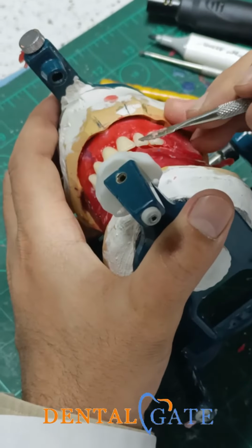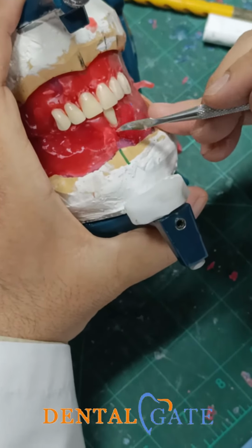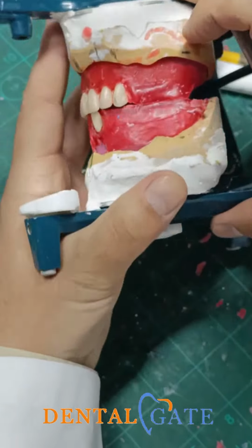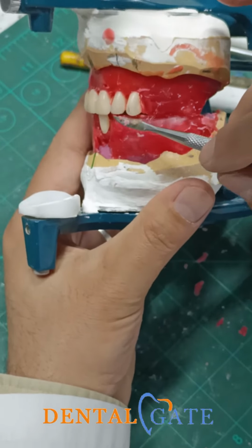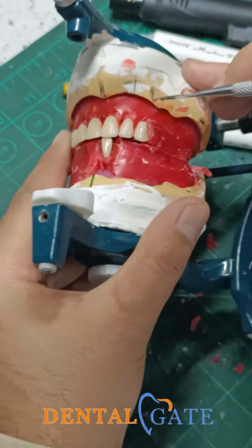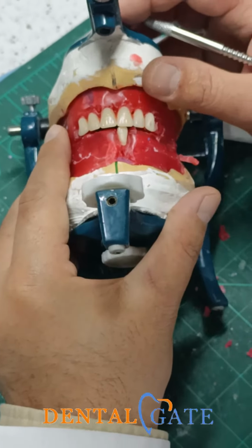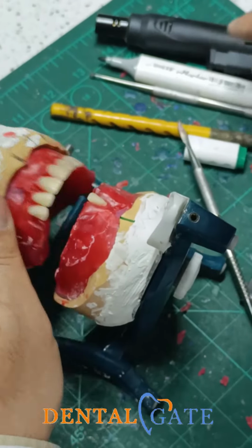Now, this is 1 millimeter. It is good. The central incisor is parallel to the vertical axis, with no inclination here and no severe proclination, because I already put it within the overjet here, and we have 1 millimeter of overlapping. There is no defect here. Now you can start with another one.